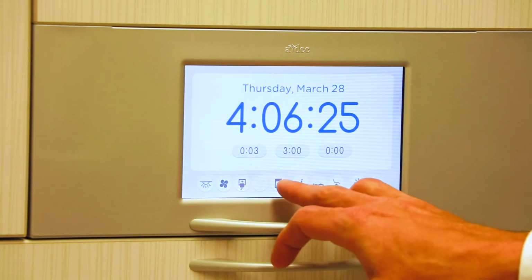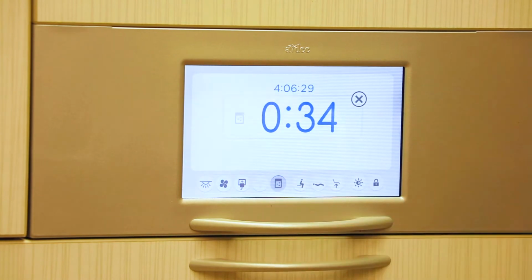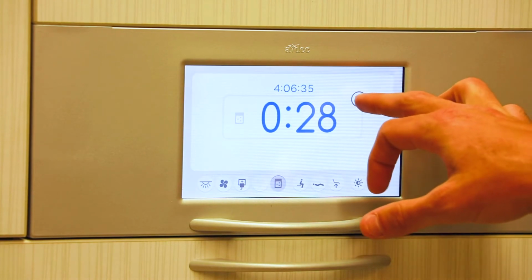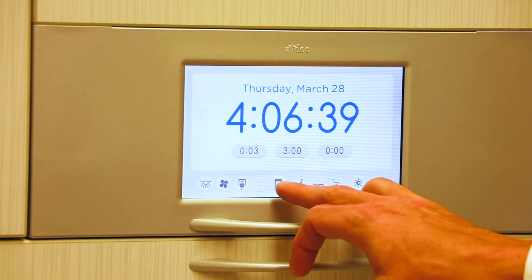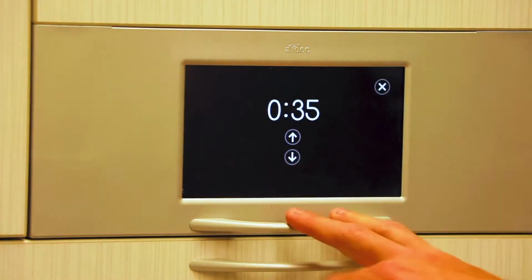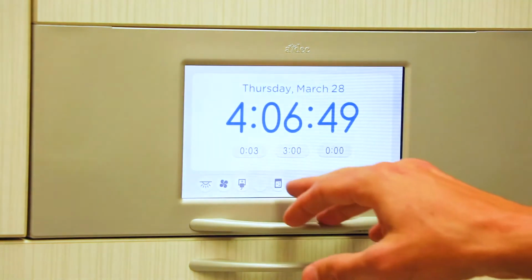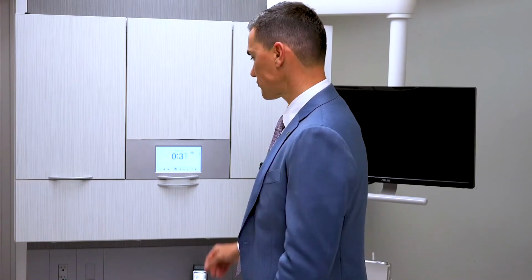The next button is actually our ICV button. That ICV button will allow us to turn on and off the tank that is going to clean our vacuum lines. If we need to actually change the time and the allotted time that the 1 liter of solution is pulled through our vacuum, we can actually hold that down, increase or decrease that time just by holding the button down, setting that time, and then when we depress that, it will start that 35-second countdown.